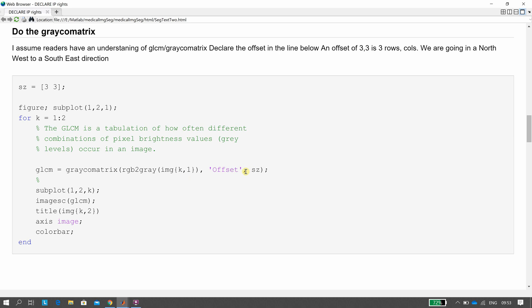Slowing down here — the offset is SZ, which is 3,3. So the offset is three rows, three columns, meaning we're going in a north-west to south-east direction. So we're trying to get the co-occurrence matrix going from north-west to south-east.